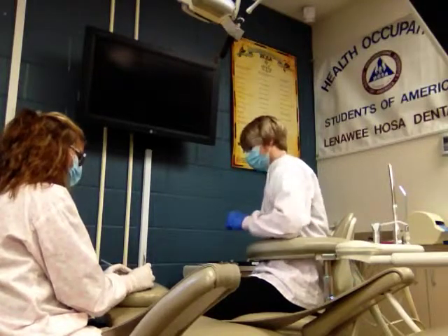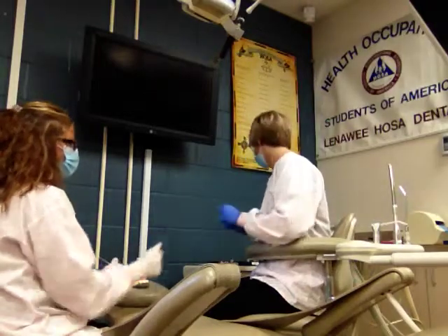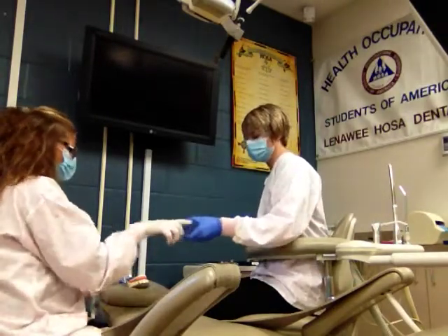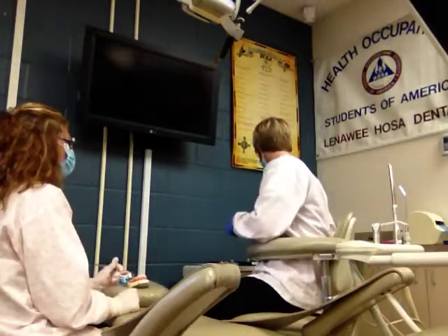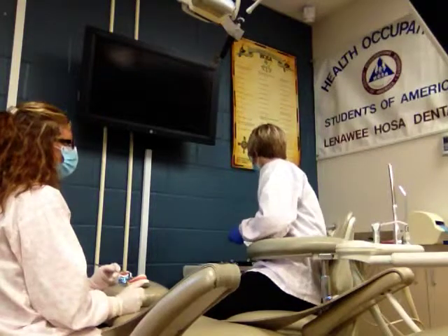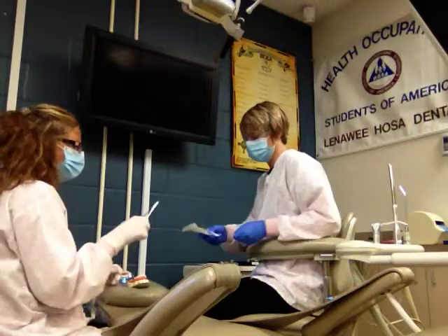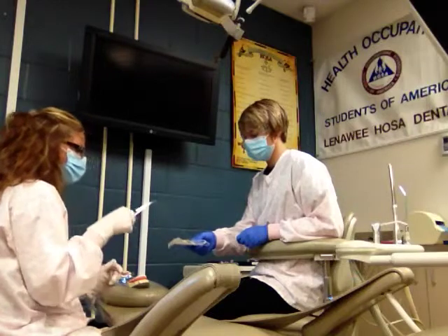Now a lot of times when we've had to use that surgical burr, there'll be some bone that is sharp and jagged. So we're going to use the rongeur forceps if needed to snip off those sharp pieces of bone. Now, once we're all good, we're going to go ahead and put sutures. Remember, anytime you use a surgical burr or a scalpel, you will need to use sutures.